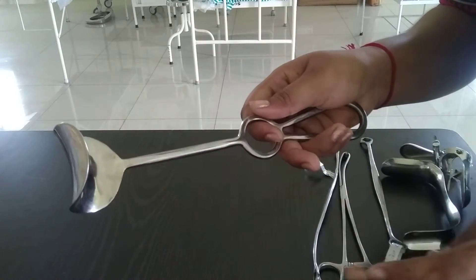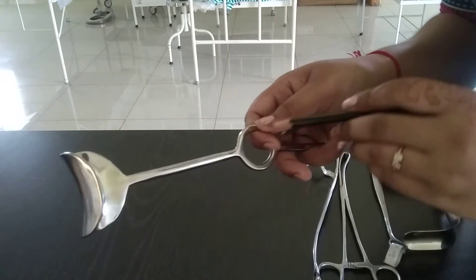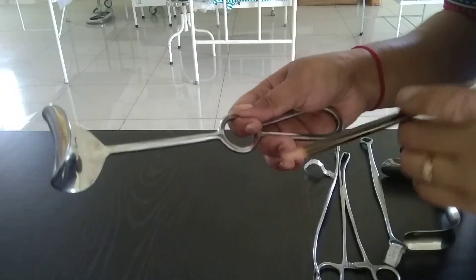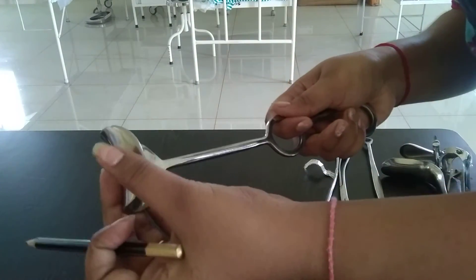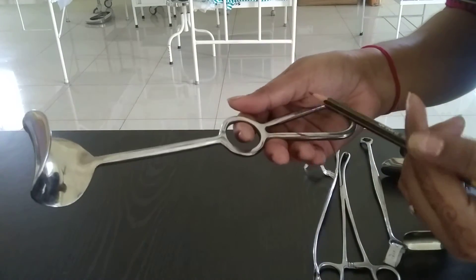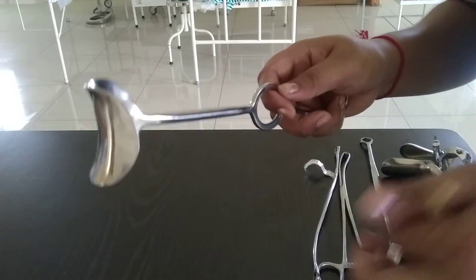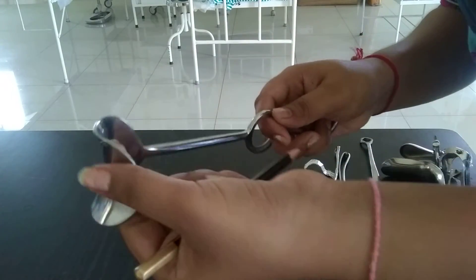It is made up of stainless steel, a heavy metal material. It is a short instrument with a strong blade. This is the strong blade and this is the strong handle. And this is the transverse blade.